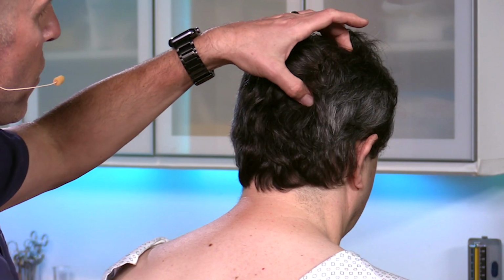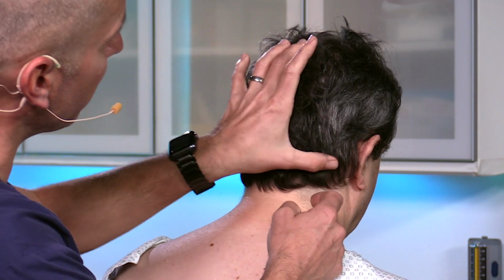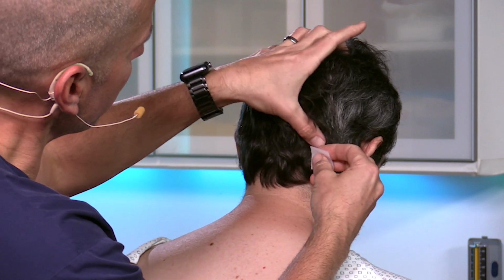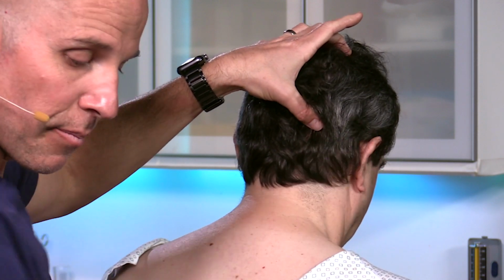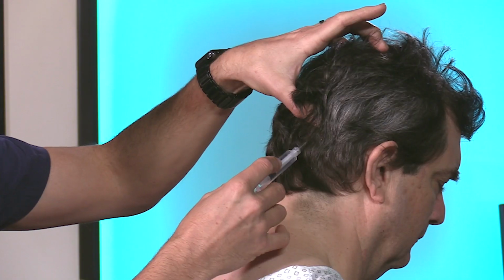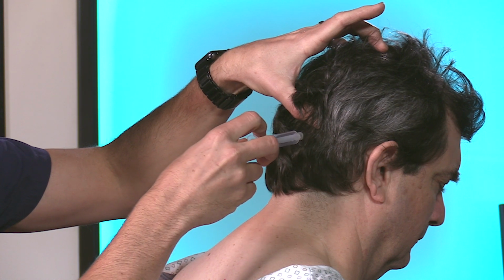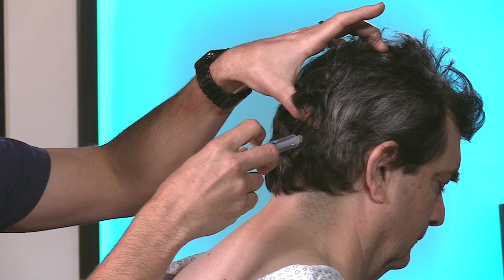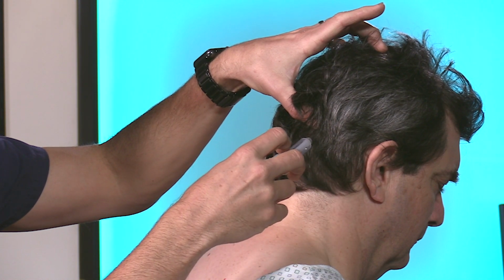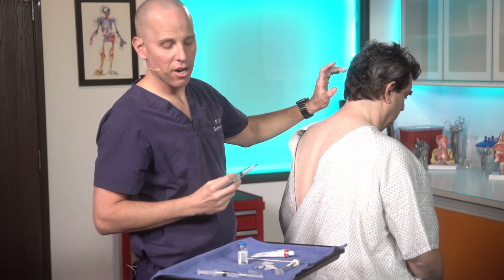So now that you have your greater occipital nerve, we'll go and do the lesser occipital nerve. Same thing, if you need to find your landmarks again, mastoid process right in this area here. I'll clean that area up. And we'll just basically repeat, right? Little sub-Q wheel, pull back, go to bone, pull back a bit, 1 cc, fan out, fan out. I would repeat the exact same thing on the other side.